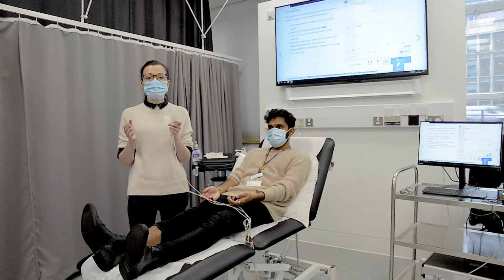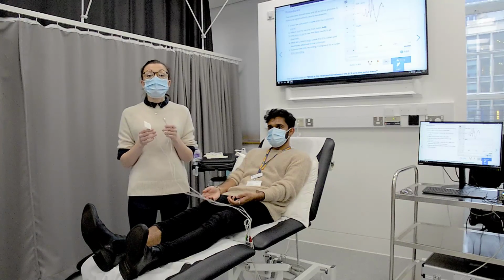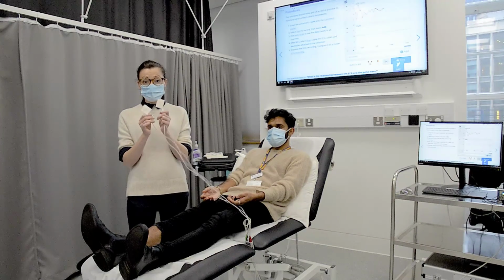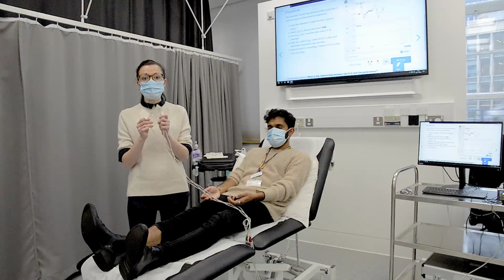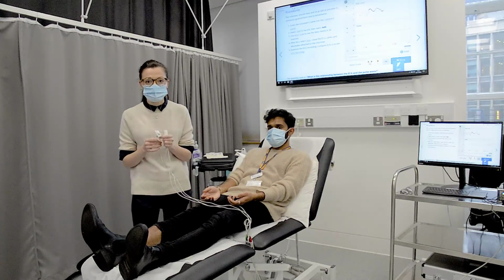And an ECG allows us to get a picture of that electrical excitation because it happens in so many cells in our heart in a very, very synchronous way and creates what we consider millivolt changes at our skin surface that we're able to capture with electrodes. And those electrodes give us a picture of what's going on in our heart during that very coordinated and synchronous event.